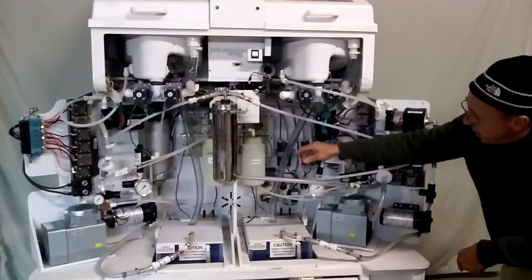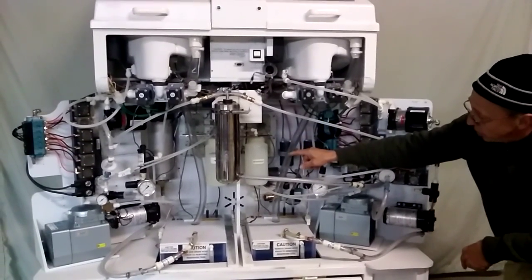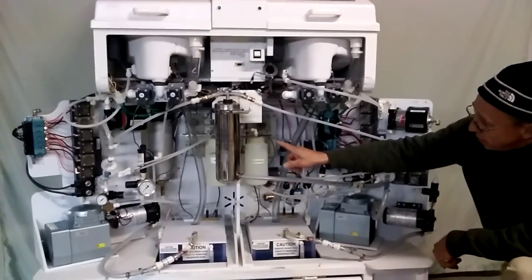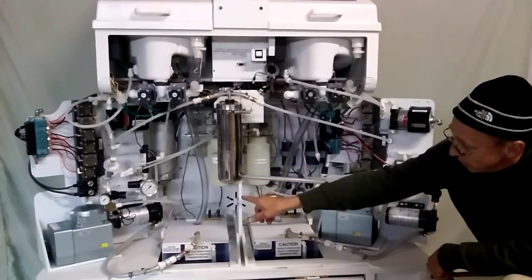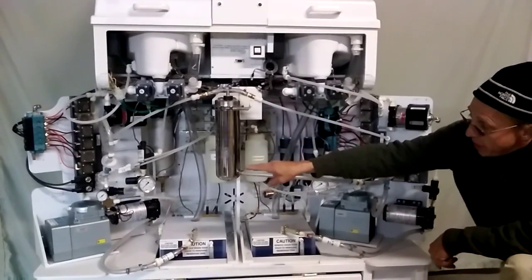You can see all the components for that right there. You have your detergent pumps on the B side here with the detergent bottle. And then on the A side, you have the alcohol bottle, the alcohol pumps. And then right over there, you'll see the air tank as well. And then there's all the components on the A side.